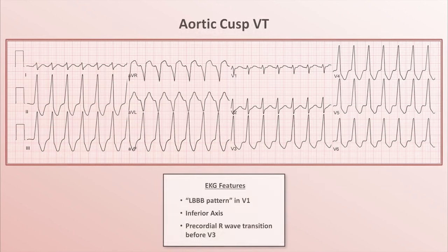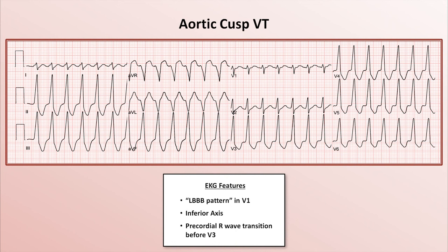Comparing that to an aortic cusp VT: the V1 left bundle branch pattern isn't quite as pronounced, and that's partially because the precordial R-wave transition is much earlier — happening sometime between V1 and V2. You might wonder: if the LVOT is part of the LV, why do LVOT VTs have a left bundle branch block pattern that would otherwise suggest they come from the right ventricle? The extremely short answer is that the heart is a complex three-dimensional anatomic structure, resulting in some empiric observations that feel counterintuitive. So it is an exception to the general rule that a predominantly negative QRS complex in V1 suggests a right ventricular origin.